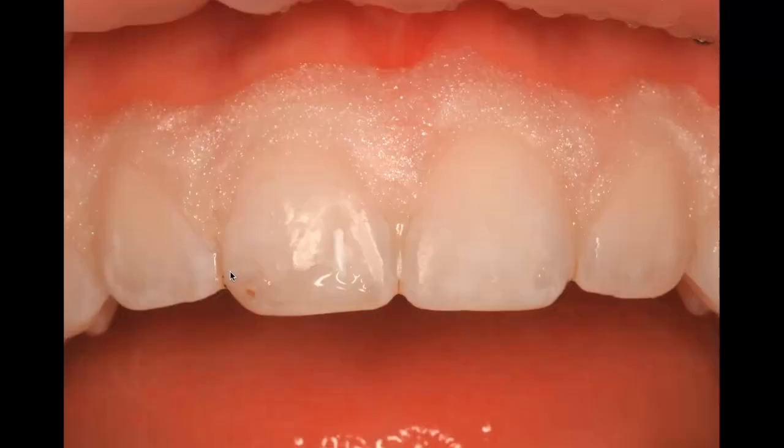Then what you do is you place an alcohol onto the tooth. The alcohol monomer is even thinner than our monomer is going to be, right? This is going to travel into the depths of the tooth, and you're going to get a little bit of a preview of what your infiltration is going to look like. So you can see here that we still haven't really accessed this white spot here. We haven't accessed this one here. We haven't accessed these. And so you can look at the tooth and say, hey, am I ready to infiltrate this or not?